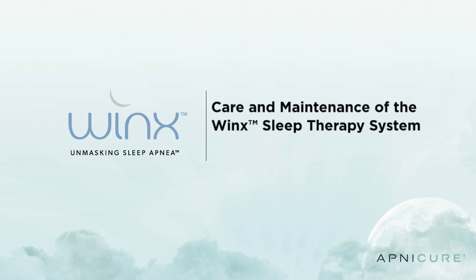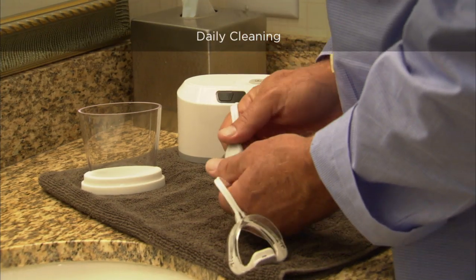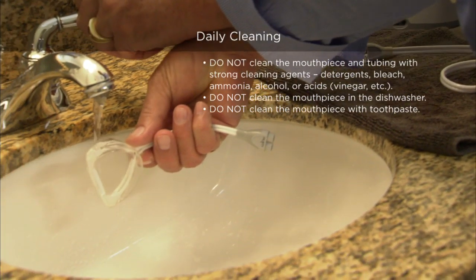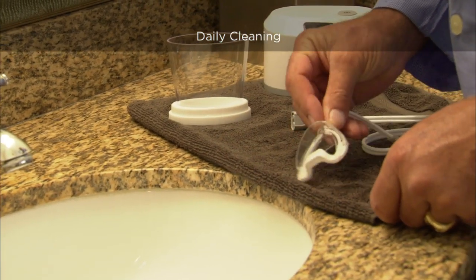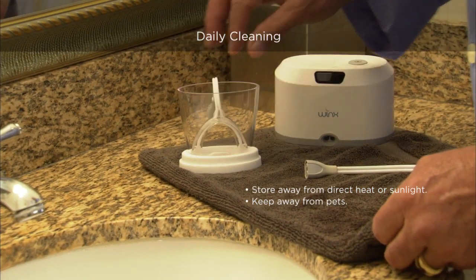Caring for your Winx Sleep Therapy System will help ensure continued and uninterrupted use of the system. Be sure to rinse and clean the mouthpiece and reservoir after each use. Disconnect the mouthpiece connector from the tubing connector. Rinse the mouthpiece in water. Do not use mouthwash, soap, or other cleaning agents to clean the mouthpiece. Shake off any excess water and dry with a clean towel. When completely dry, place the mouthpiece in the mouthpiece holder for safe keeping.